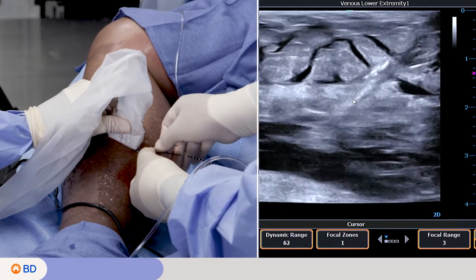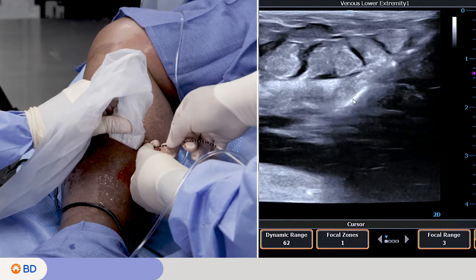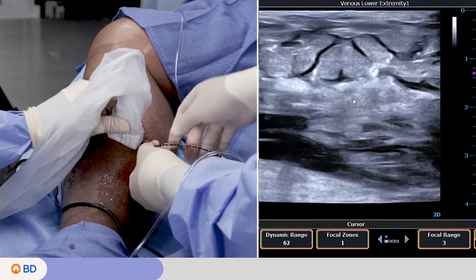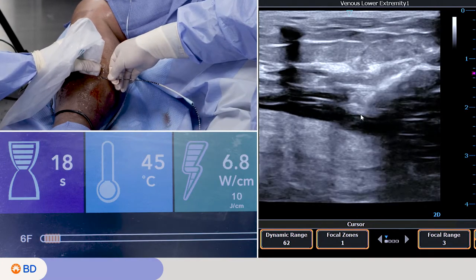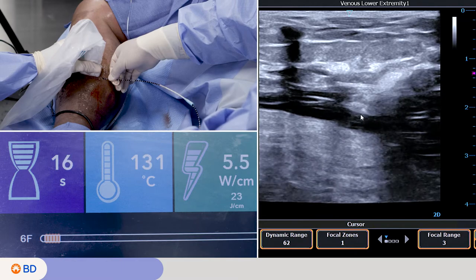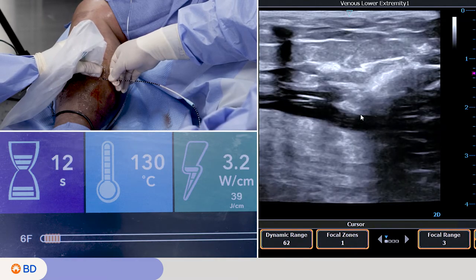Prior to treatment, if possible, place the catheter's heating element at or below the deep fascia for the first treatment segment. Use fluid anesthesia to protect deep veins. Ensure good vein wall apposition with the heating element by applying external compression.